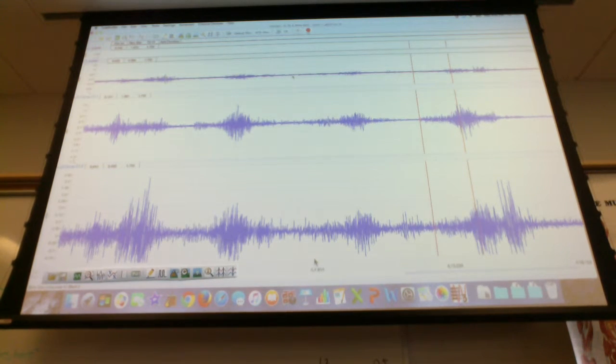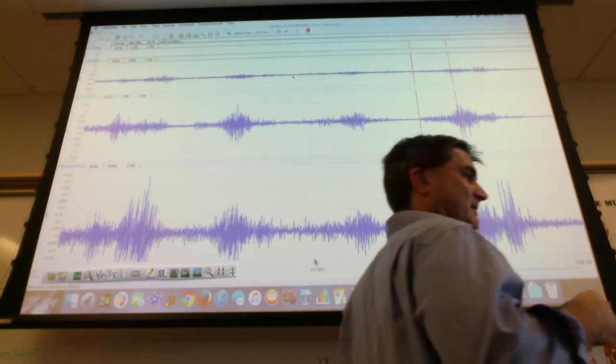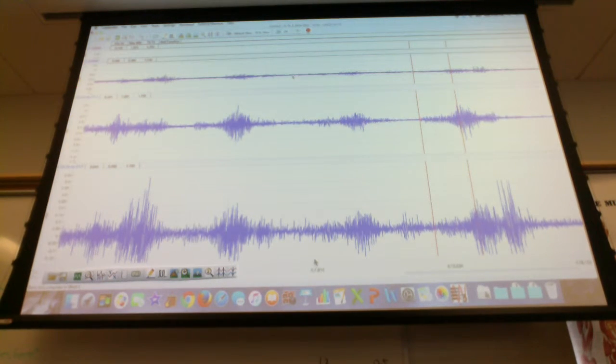Okay, has everybody got their three values for that first set of things? All right. The next thing I want you to do is find one of the really good flexions, or extensions, that you can find, and see if you get the value for that. Some of you guys have things that are a little bit odd, and the flexions are a little bit harder to find because there's not as much force being used. But find the best flexion you can and record data from that. And again, you're going to get information from the anterior and from the posterior.